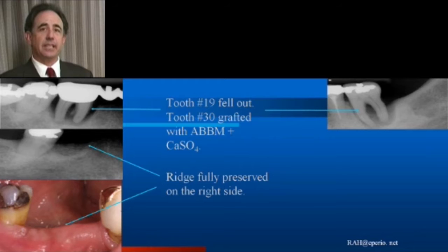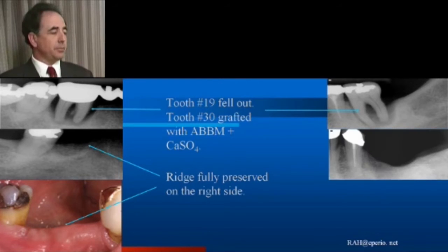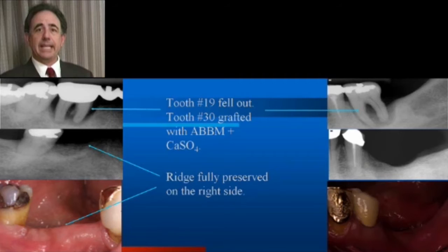However, if we look carefully at the X-ray, even at 8.5 years postoperatively, we still see the graft material in place on X-ray. We know that if a graft material is still in place radiographically at this time period, clinically the graft material will still be there if we look histologically. The problem with the graft material remaining histologically in alveolar bone is this can change the quality of the bone. Bone itself is an elastic, remodeling, vital structure.